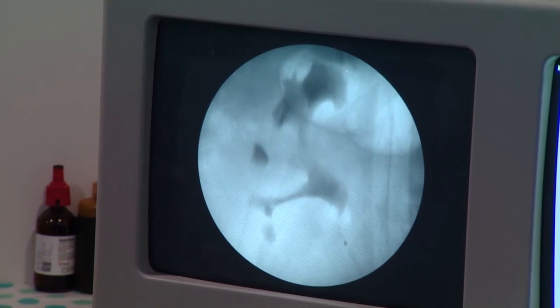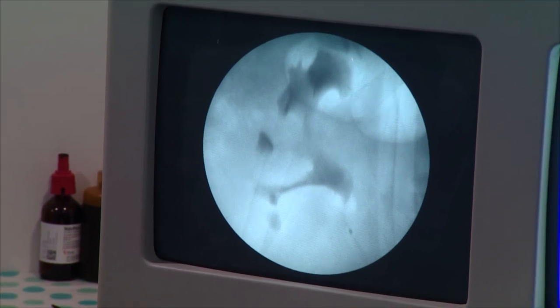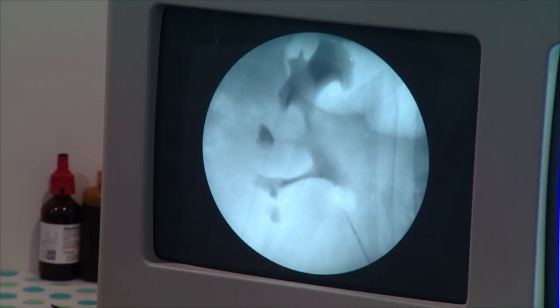Hold it properly once more. No, we lost the connection to the renal pelvis. Once more, X-ray, please. There's a certain kinking. Do we also have a Terumo guide wire?